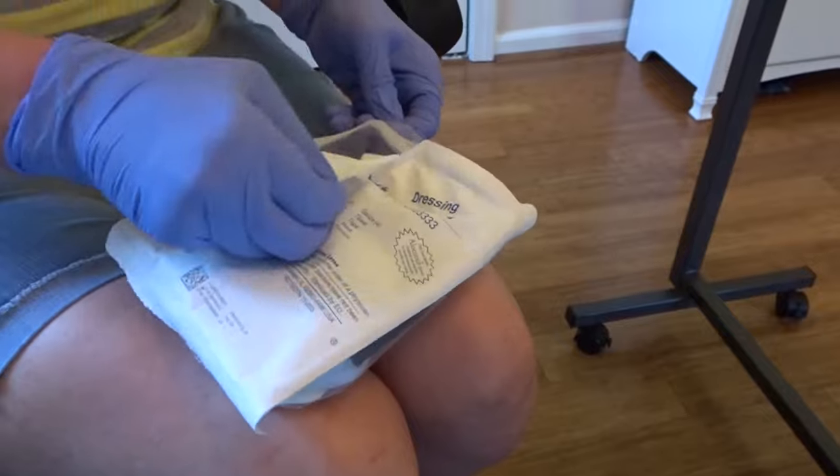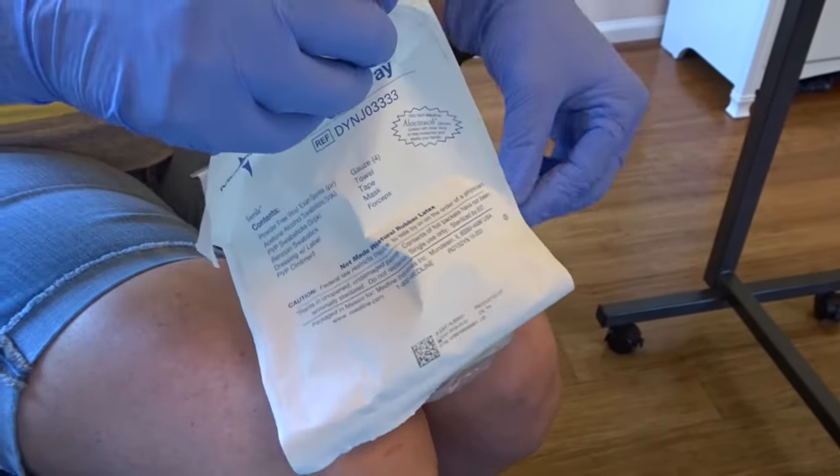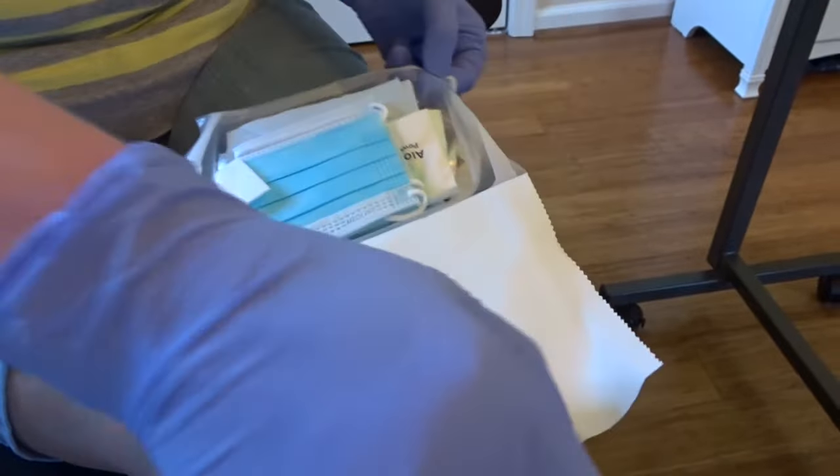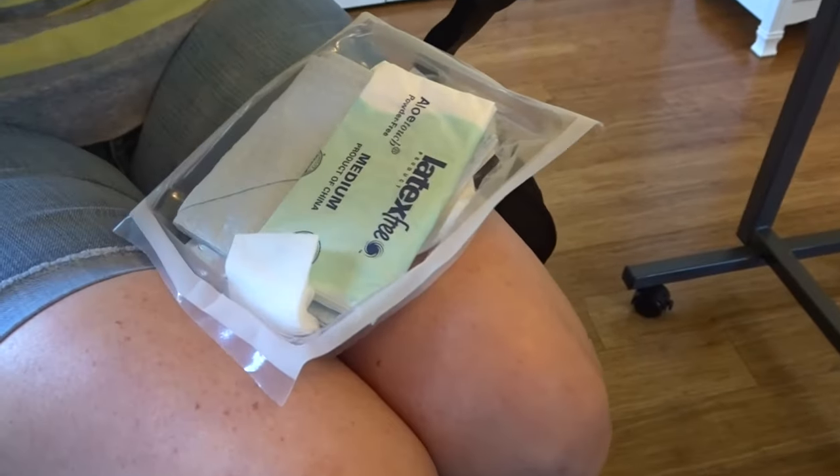The kit contains everything necessary to do a dressing change: a sterile field, sterile gloves, a dressing, antiseptic, gauze, tweezers, skin prep, tape, and masks.